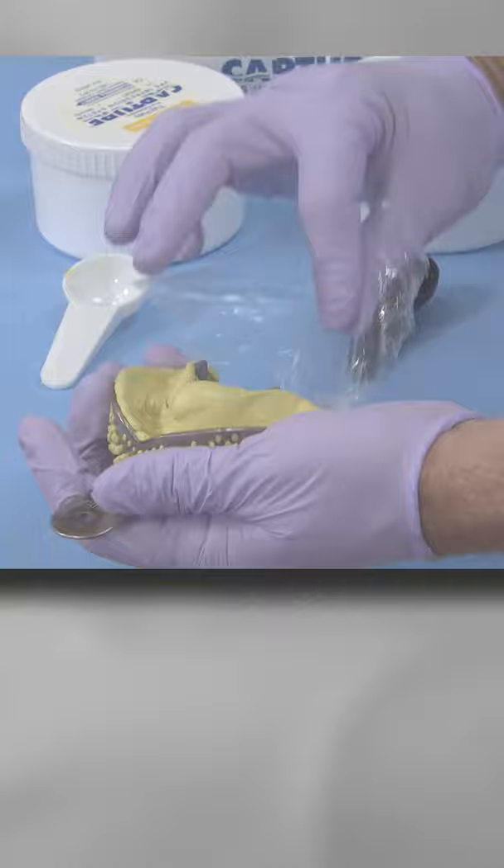Once the material stops squeezing out, ask your patient to open and immediately remove the impression tray. Now the plastic sheet can be removed and you have a VPS custom tray.